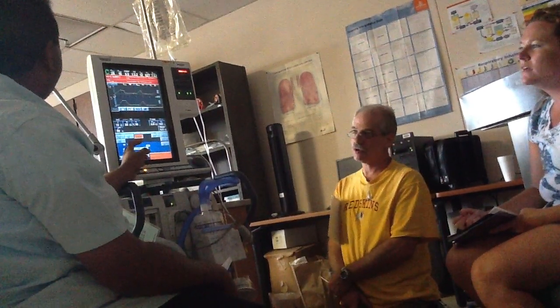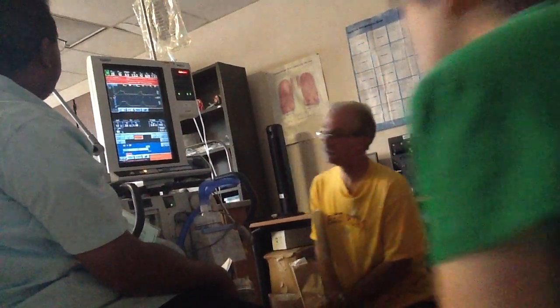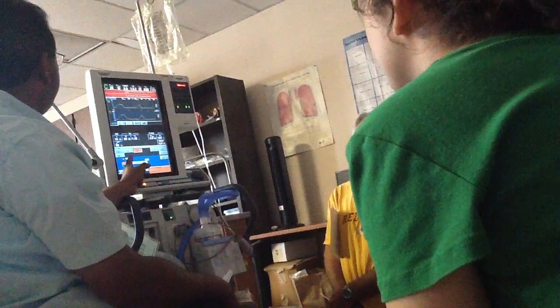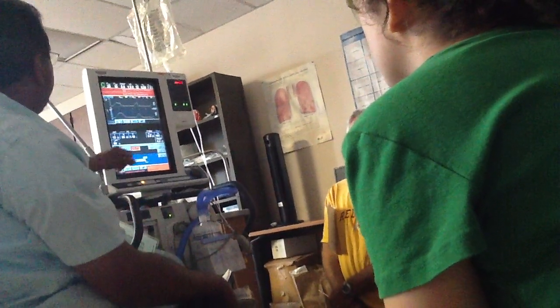Can you unlock them all? Right, IE is locked. I thought it was TE that was locked. Yeah, that's right. You can just play with it. The TE was locked right there, wasn't it? Now the I is locked. Now the IE is locked. So every time this lock button is pointing down to whatever it is, it's just lock, unlock, lock, unlock. You just have to play with it.